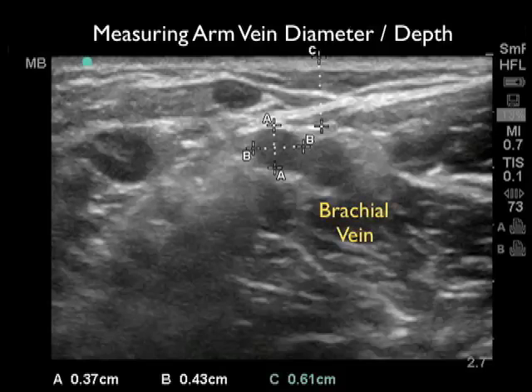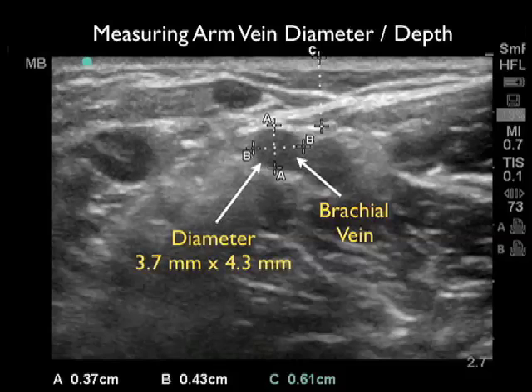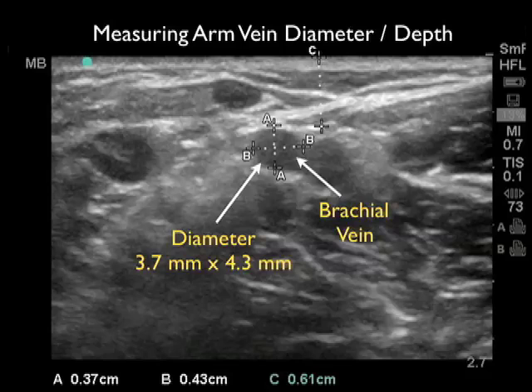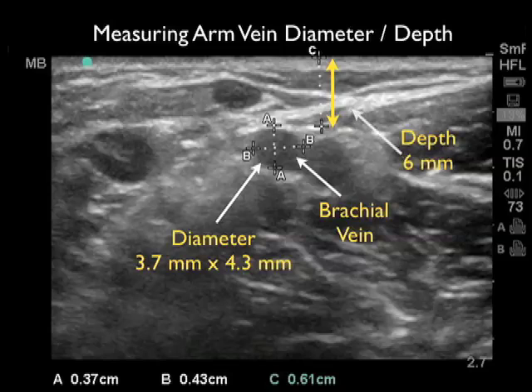Armed with the knowledge of that study, here we're going to measure the diameter of a brachial vein prior to a puncture attempt. We've selected a brachial vein and we're measuring the diameter at 3.7 mm by 4.3 mm. This would correlate with a low likelihood of success during a cannulation attempt. Notice also we're measuring the depth of the vessel, which is 6 mm — less than the 1.6 cm that correlated to no successful outcomes — however, the diameter of this vessel would be very difficult to cannulate.